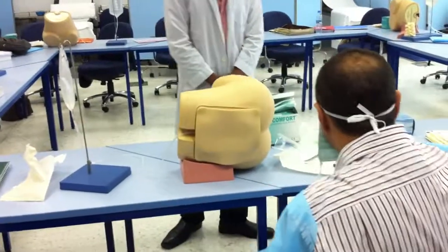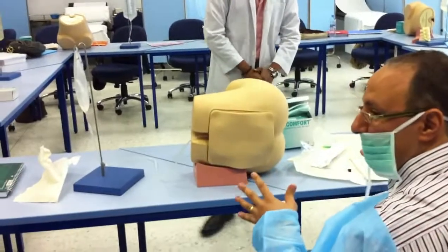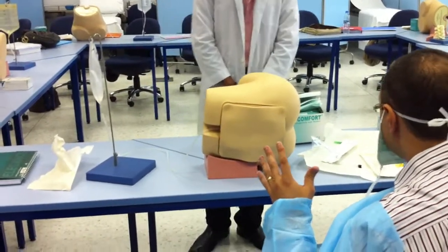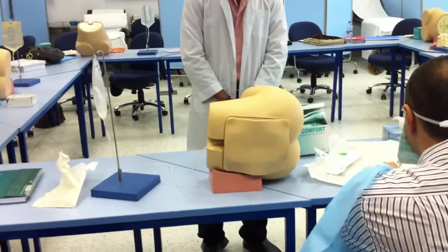For the spinal technique, you have to wash your hands. A complete set of drapes and a complete set of Betadine for sterilization will be with you. You are going to wear the gown, wear the mask, and wear your gloves.